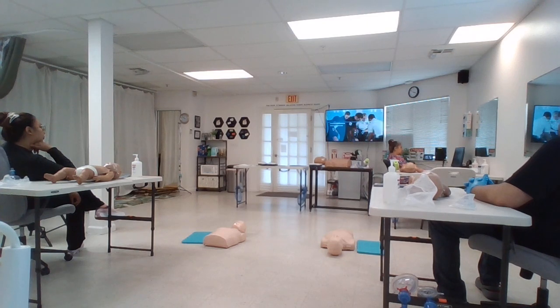The last category is how to communicate. Closed-loop communication is the process of verifying that the message sent was received as intended. It also verifies that any assigned tasks have been completed. This is our first round of CPR. We have one shock on board. Got one shock on board.